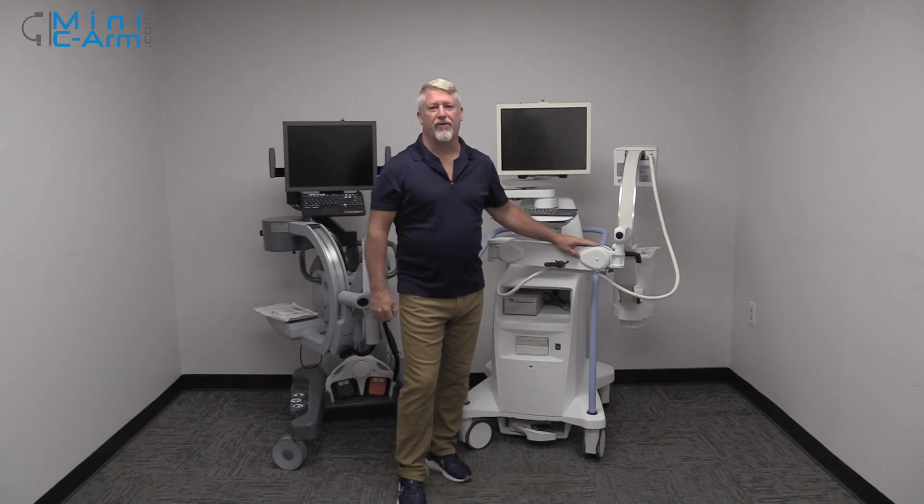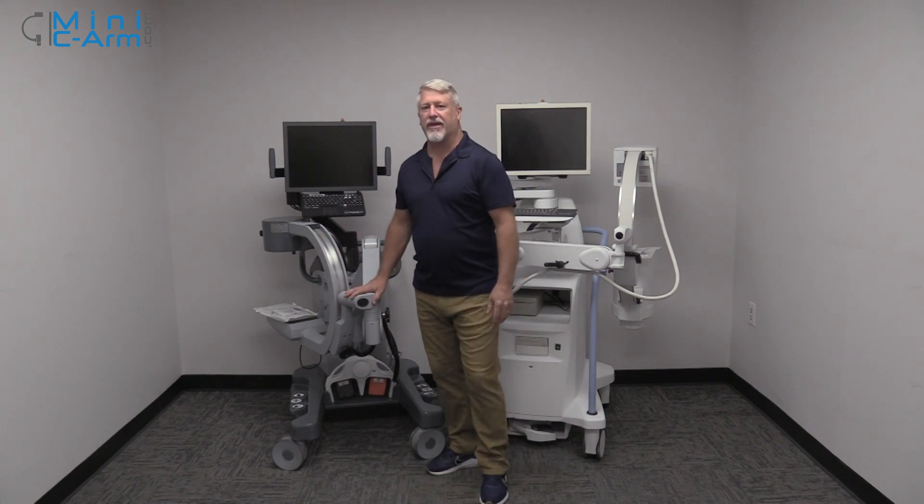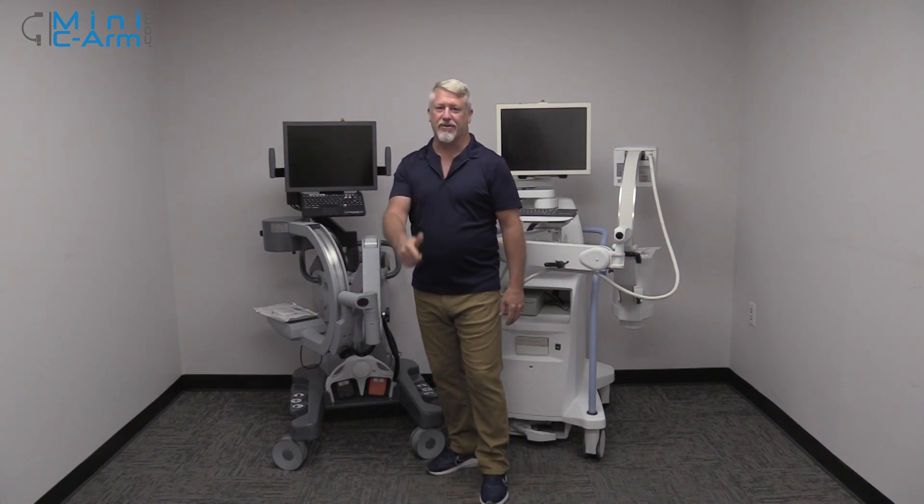Hi guys, I'm Christopher Bacon, founder of OrthoScan and president of MiniC-Arm.com. Today we're going to show you how to drape a Mini C-Arm. Over here we have a Hologic Insight 2 and over here we have an OrthoScan FD. Let's get into it.